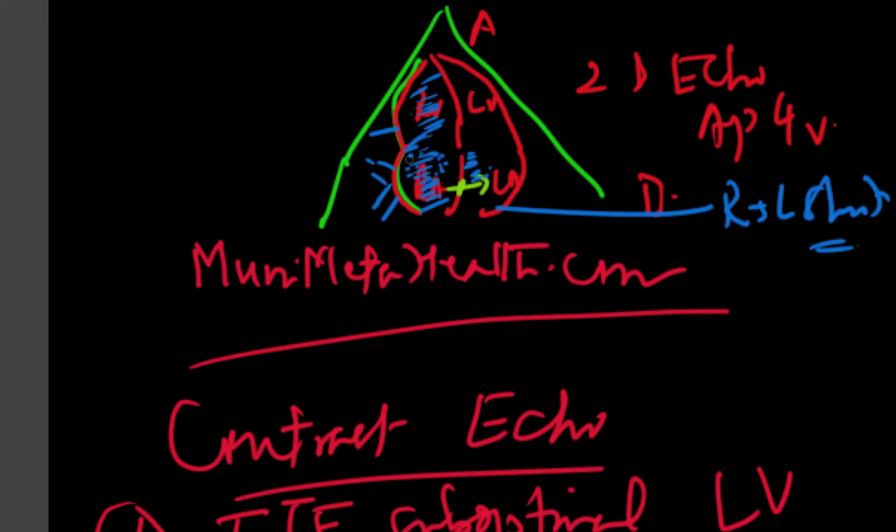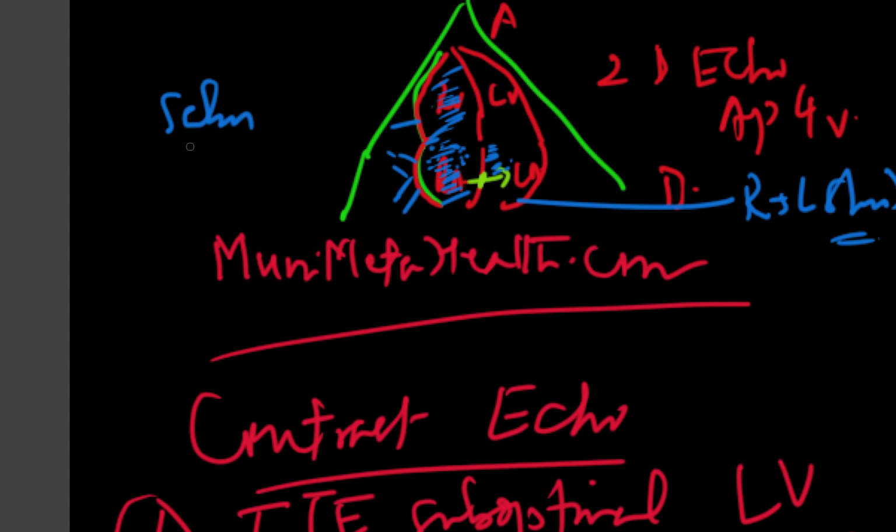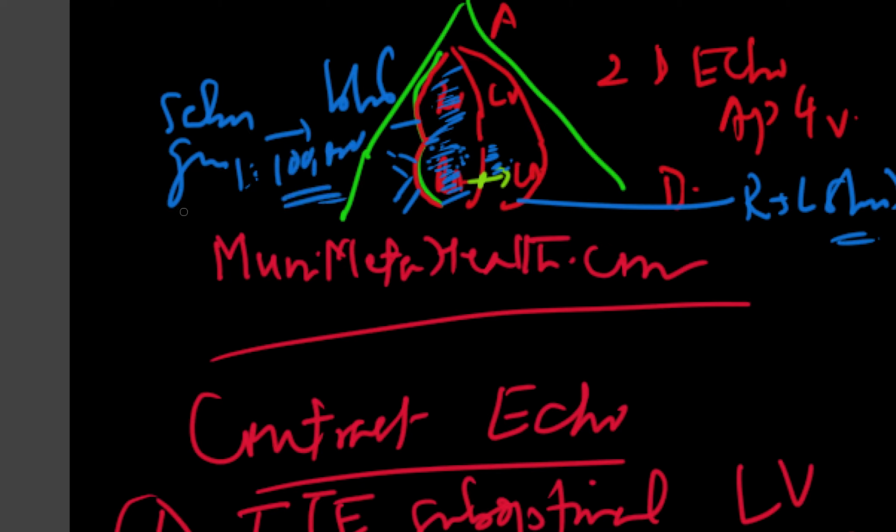And therefore what happens is you have this, obviously lighter in the sense that it's less dense. It's 100,000 times less dense if you were actually to look at it. Between the blood and the saline gas bubbles, the ratio is almost 1 to 100,000. So that is the ratio of the densities. The gas is so light that it's 100,000 times lighter. So there will be enough contrast between the RA and the RV right away that will be seen.